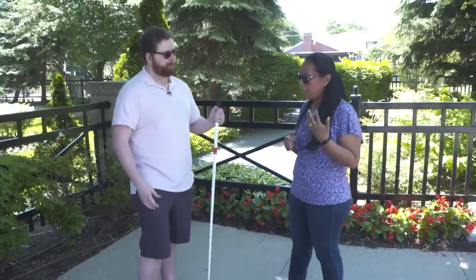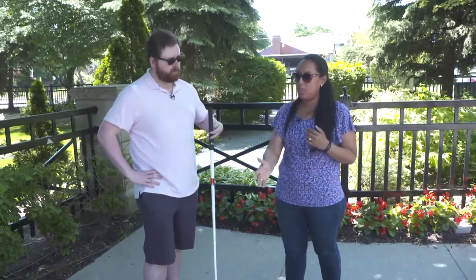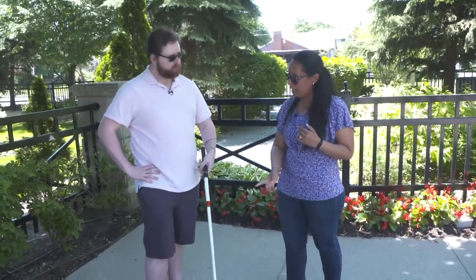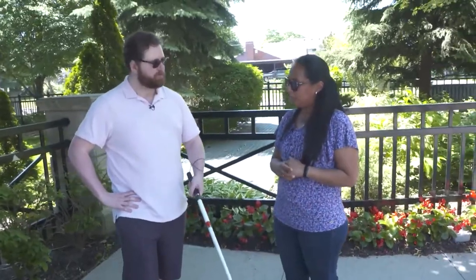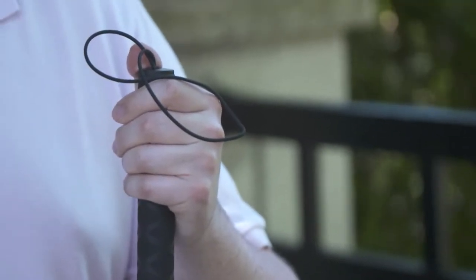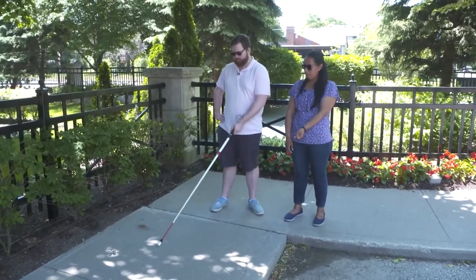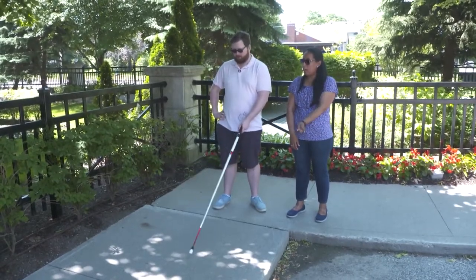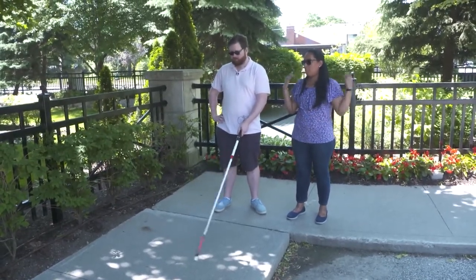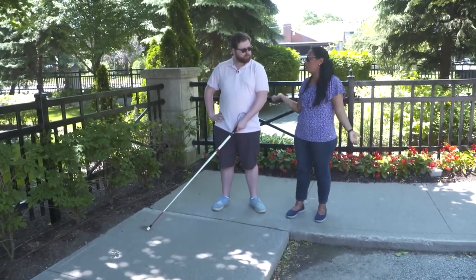Anita Laurinaitis: So the first thing we're going to talk about is how to hold your cane. You want to hold your cane as if you're reaching out to hold somebody's hand — hand out like that. You're going to have your thumb and index finger wrapped around it. You're going to have that cane at midline, so in the middle of your body. And you're going to flex it from your wrist back and forth. You're going to cover the widest part of your body — that's your shoulders, about an inch past each shoulder.